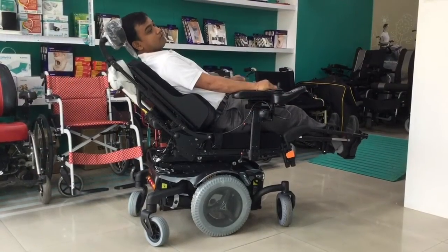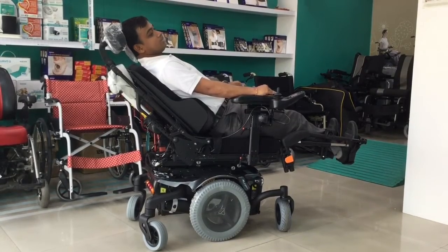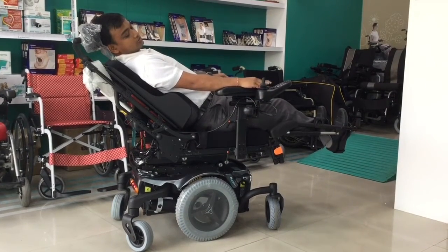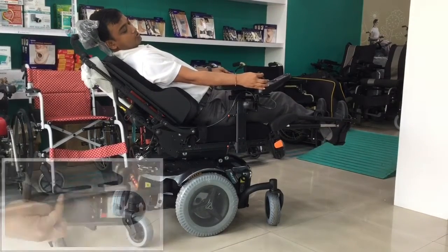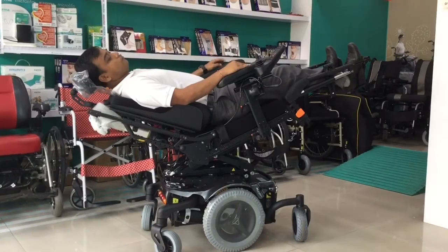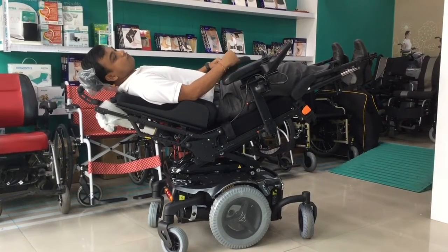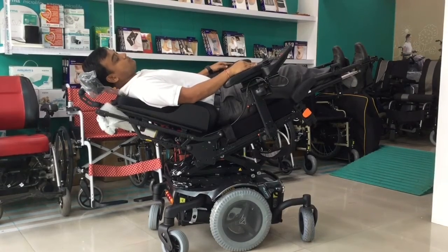You can recline your backrest up to 170 degrees. Now I'm in full recline mode, and in this mode you can relax very easily. You can also do the tilt when you are in fully recline mode. You just need to adjust the option to tilt and press this knob. My chair is tilting out. I am in a full tilt and recline position. In this position, I am able to distribute the pressure fully across my whole body and feel completely relaxed.